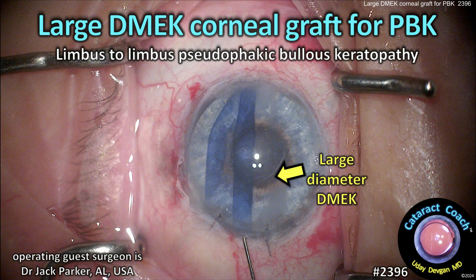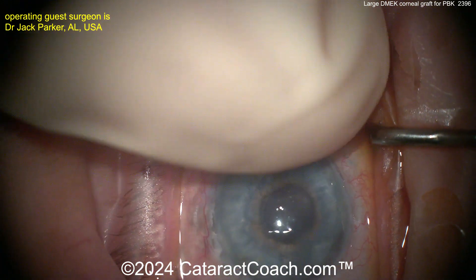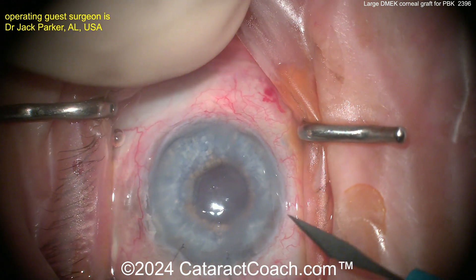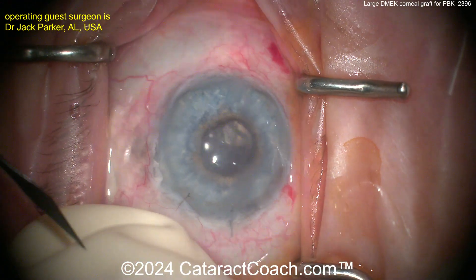cataractcoach.com — a large DMEK corneal graft for pseudophakic bullous keratopathy, limbus-to-limbus pseudophakic bullous keratopathy. Our guest here is Dr. Jack Parker, who does an incredible volume of these, more than a thousand a year.